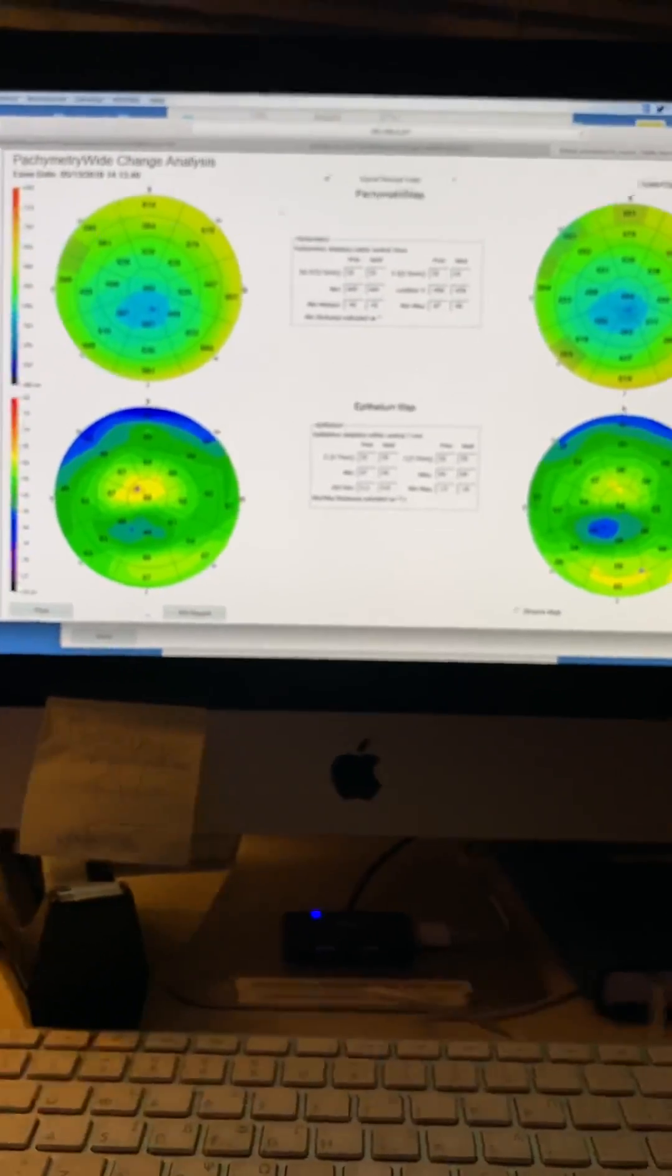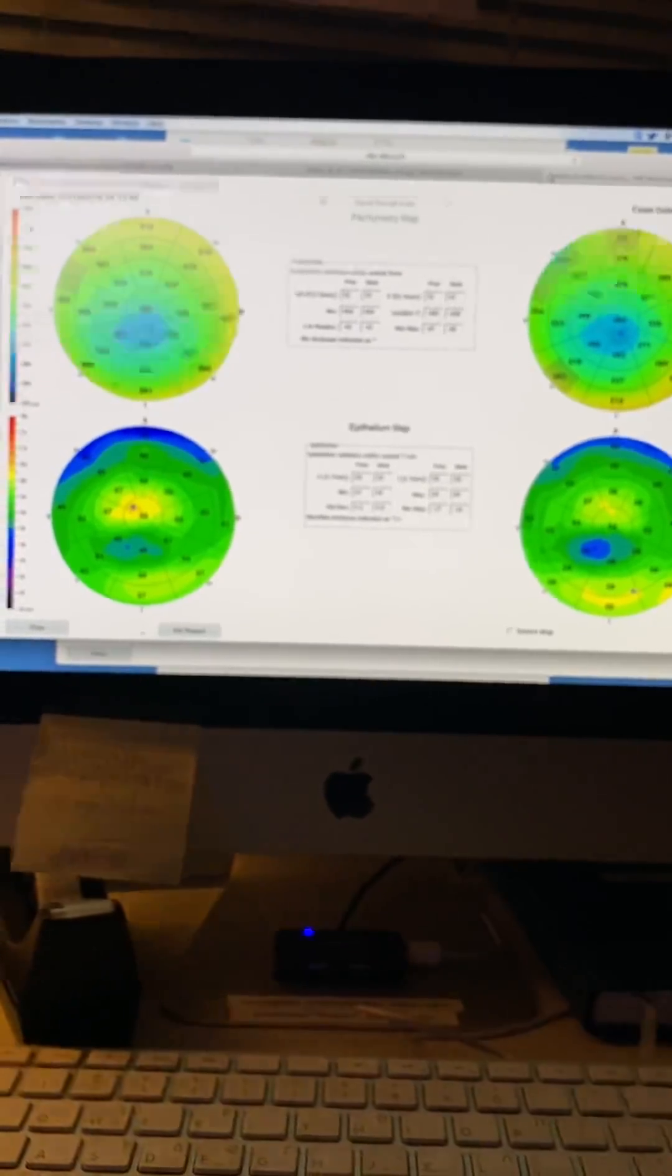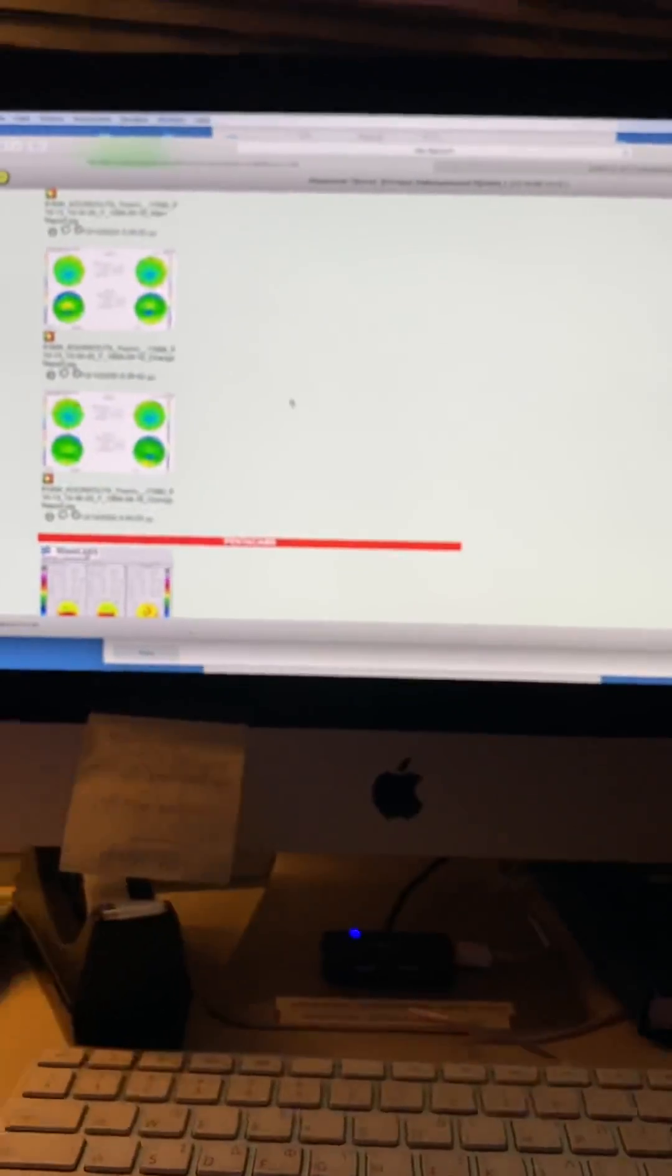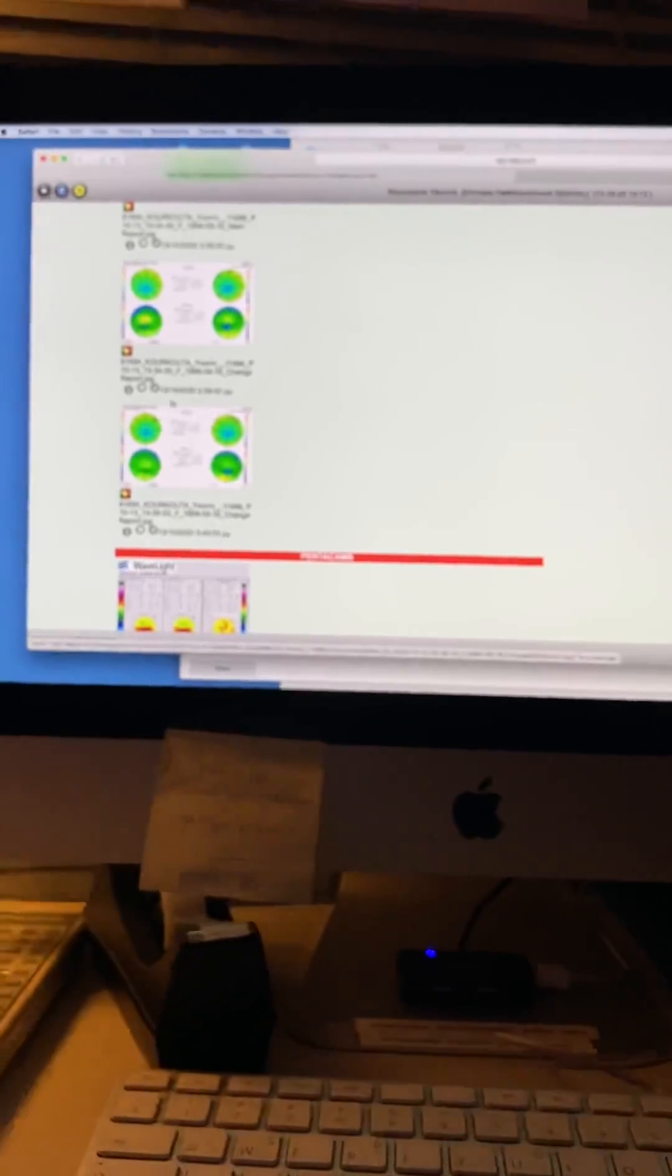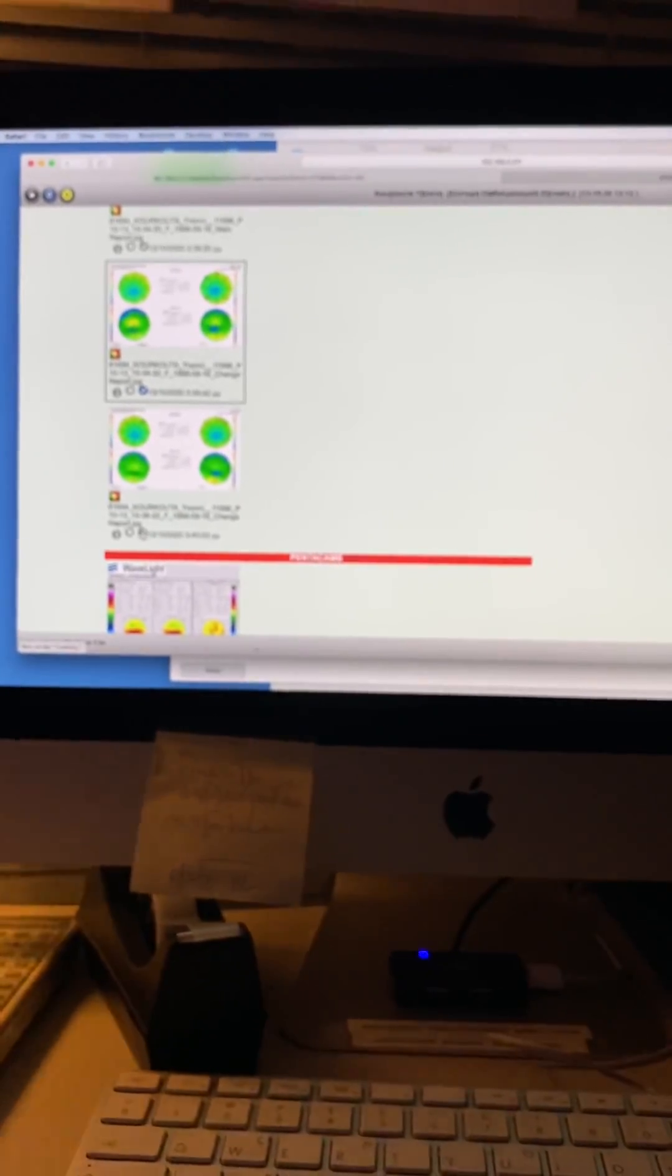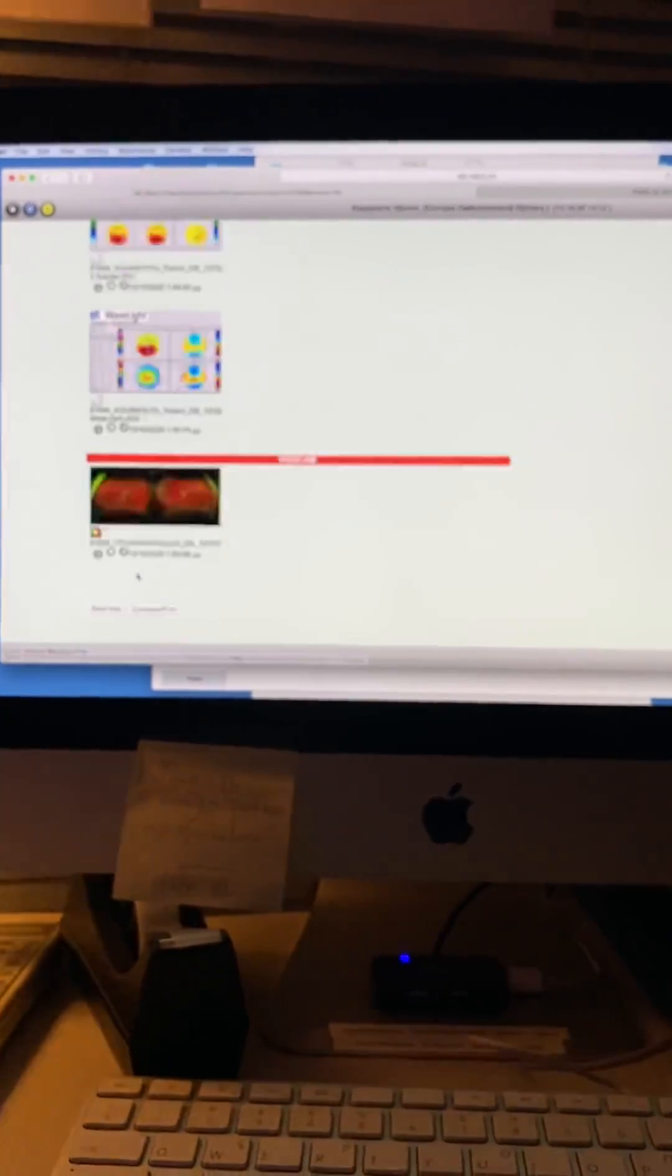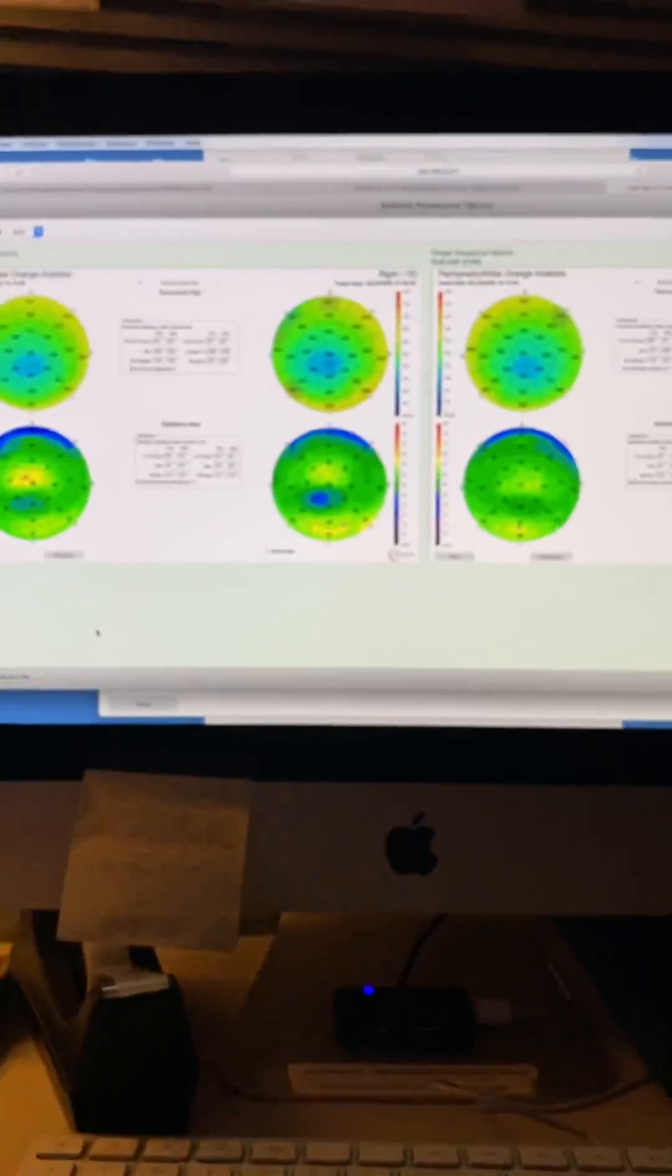This patient, in my opinion, of course, demands counseling. Not to rub the eyes. Number two, in my opinion, needs to have cornea cross-linking. We're going to look at those maps again.